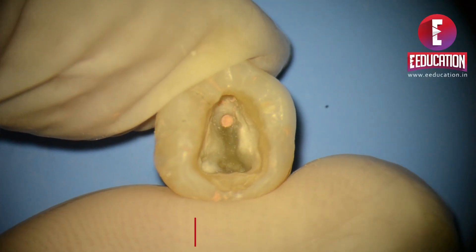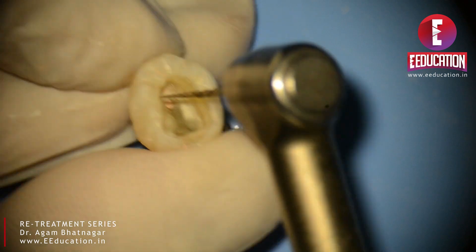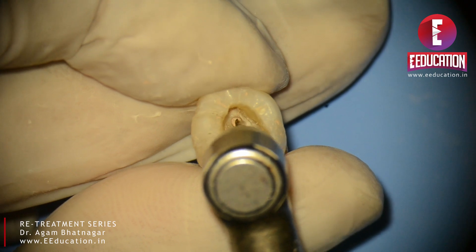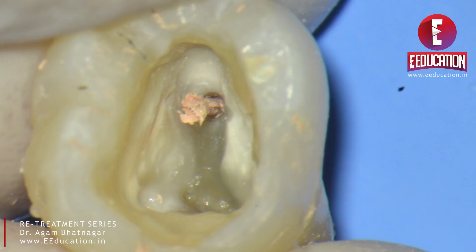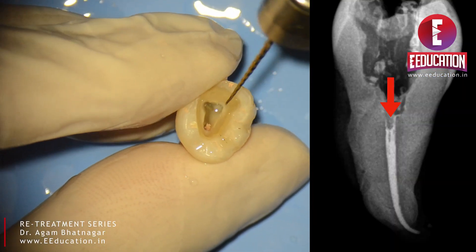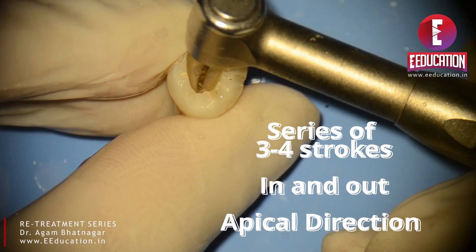Here's a lower molar with a slight apical hook or mild curvature. We begin by drilling a pilot hole into the gutta percha using the orifice shaper of the HyFlex Remover system — determining the direction of entry, which is extremely important, then starting the process. The stroke utilized is a short insertion with mild apical pressure. Do not push the file; then disengage. GP will start coming out in flakes. Irrigate, and in the space created, start using the HyFlex Remover with the same in-and-out motion and very mild apical pressure. Do not push the file — let it do its job.